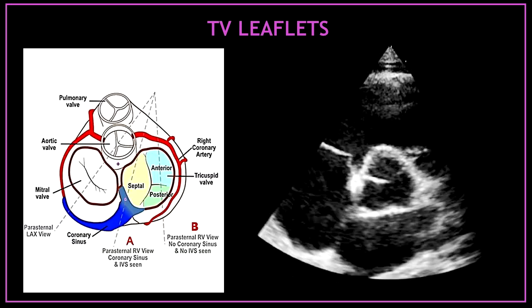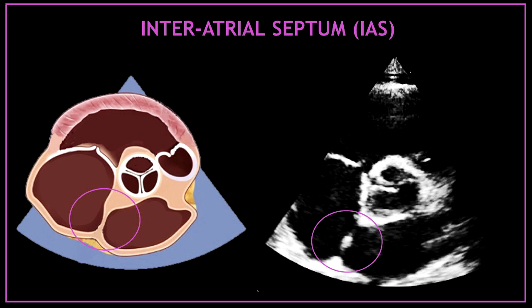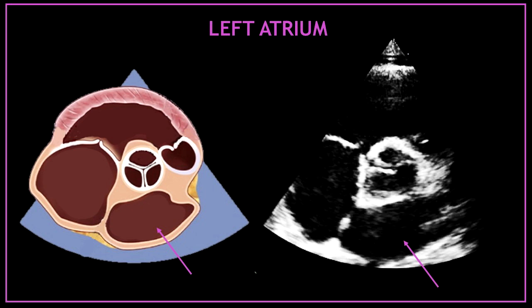In this picture you can see which tricuspid valve leaflets you can encounter depending on the cut. Lower down, that black space or echo-free space under the tricuspid valve is the right atrium. That thin line dividing two chambers is the interatrial septum. This large echo-free space at the bottom corresponds to the left atrium.